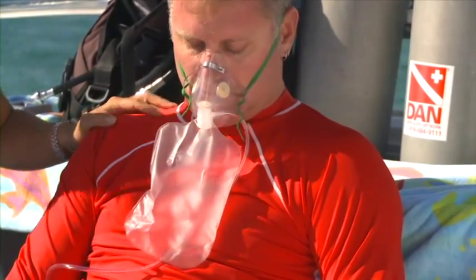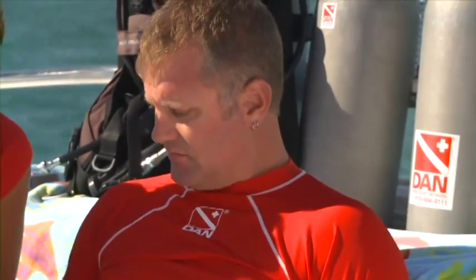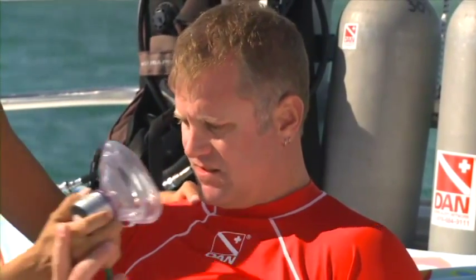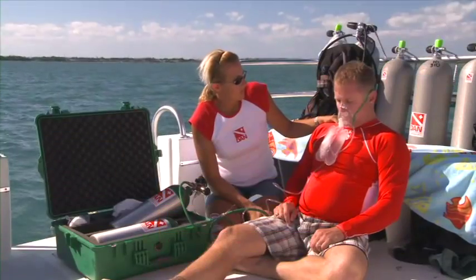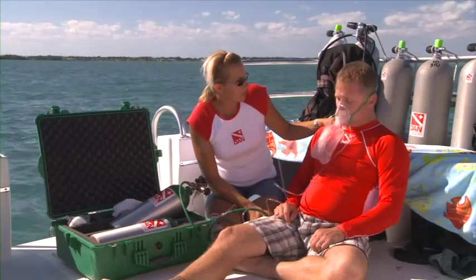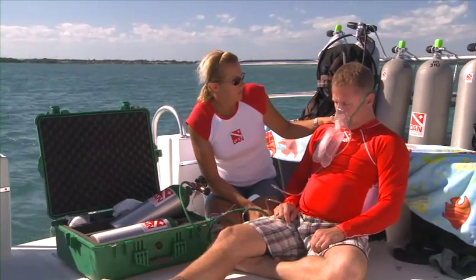If the injured diver continues to completely deflate the reservoir bag, encourage them to switch over to the demand inhalator valve. Place the injured diver in the proper position and comfort them. Activate your emergency action plan and call DAN.